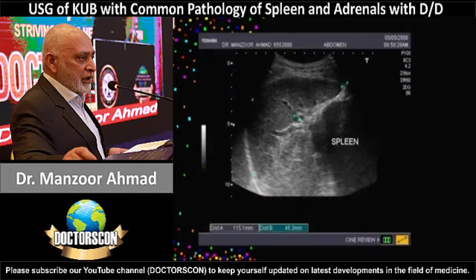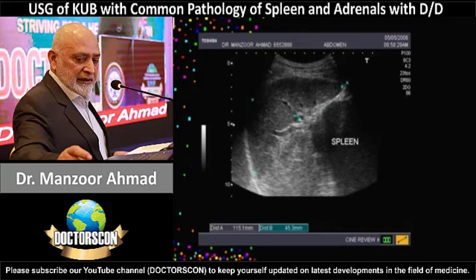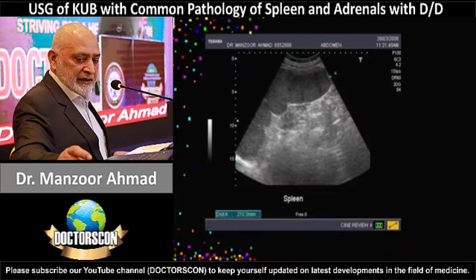This is the spleen. How we measure this: the length of the spleen from its superior to the inferior edge, and from hilum to the outer convexity is the thickness of the spleen. We measure these in centimeters and multiply to calculate the splenic index. This is an enlarged spleen. The length is 21 centimeters. Normally it is just 12 centimeters.